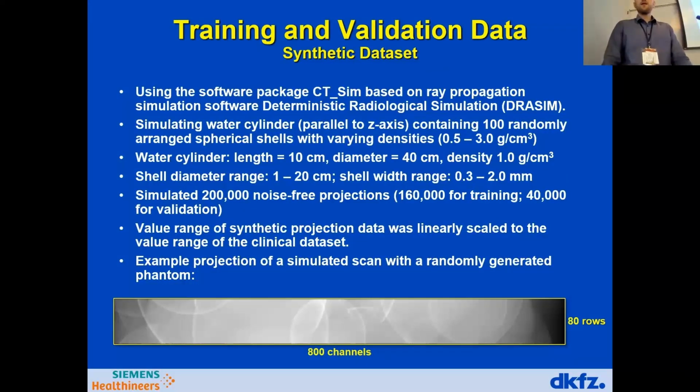Next question, please. Hi, thank you for a really interesting talk, and I thought the results were really cool. I was interested in hearing a little bit more about whether you noticed any qualitative differences in the performance of the network trained on the clinical versus the synthetic data set in terms of generating the interpolated rows. And as a general follow-up, if you had compared to a baseline that is using nearest neighbor interpolation instead of linear interpolation on the detector rows.